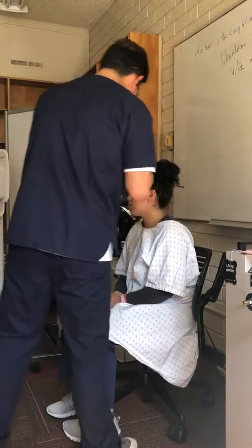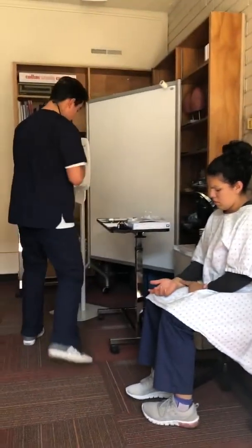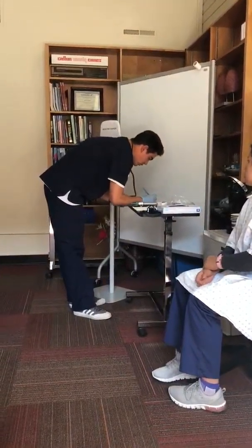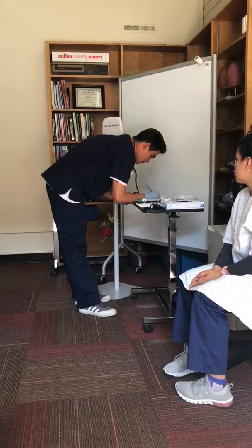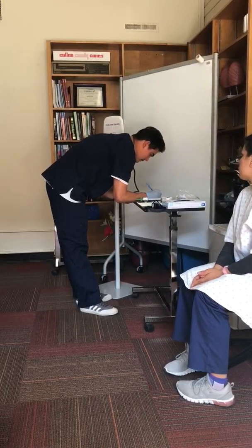Okay. Thank you very much. So noting S1 and S2, good rate, rhythm, and quality at about 60 beats per minute, strong and regular.